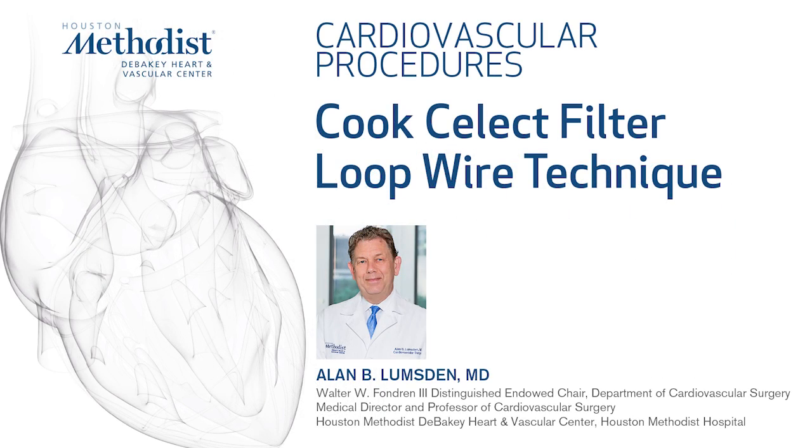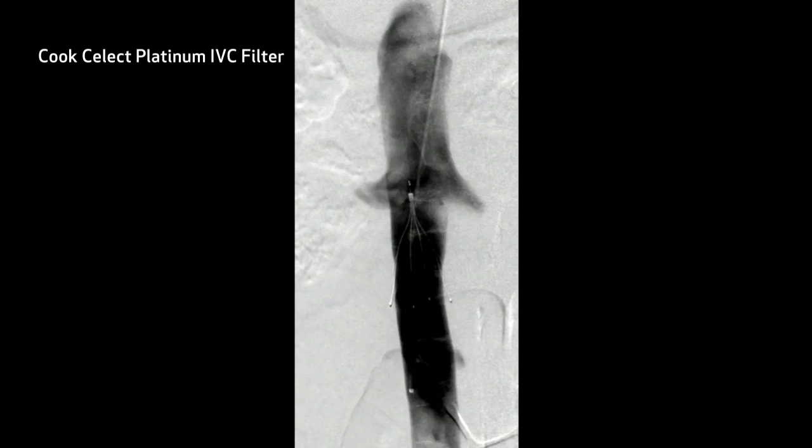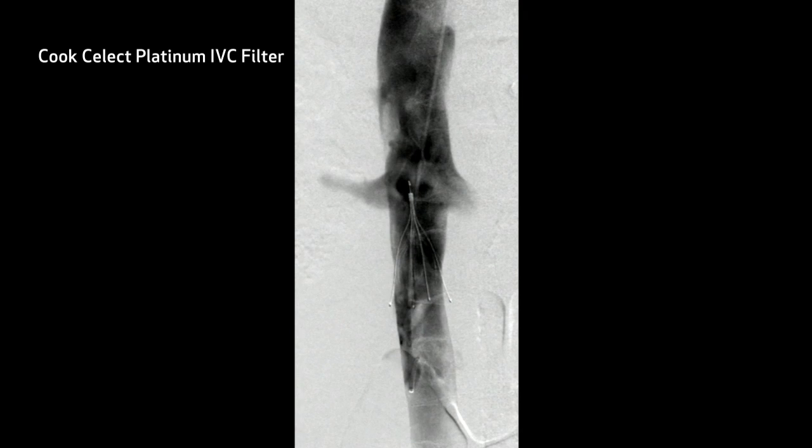This is a video which is going to show us removing a Cook Select filter from a jugular approach. We can see it's been speeded up significantly.